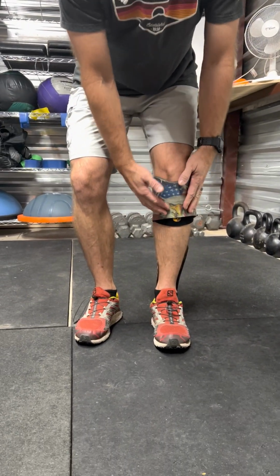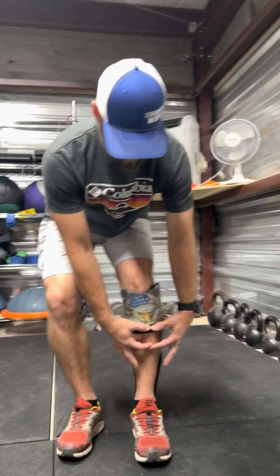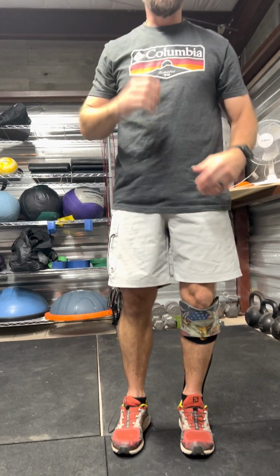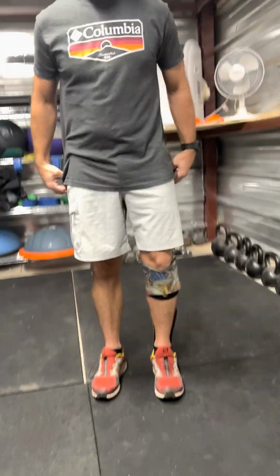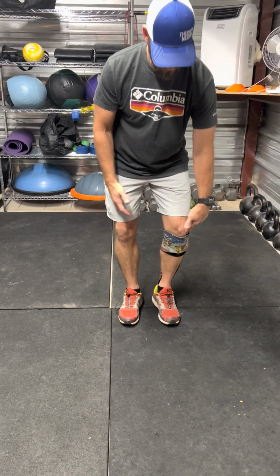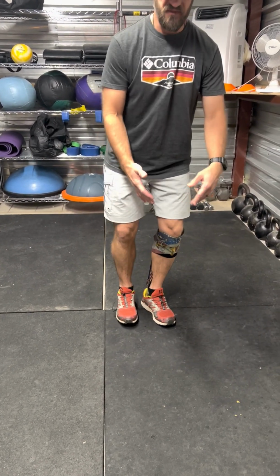That's for the exosym. Like the other ones with the BOA, you have to tighten it up, and it holds you underneath here like this. It tightens up, and that kind of holds them up, as long as your prosthetist or orthotist knows what they're doing. So my weight is being transferred into that cuff, through the struts, and then through that forefoot. The heel really doesn't do much then. That's how they designed this. So that was one of the questions, like, how is it unloaded?